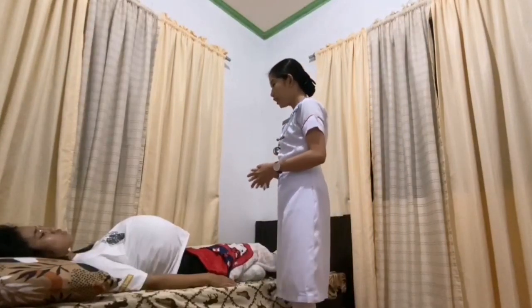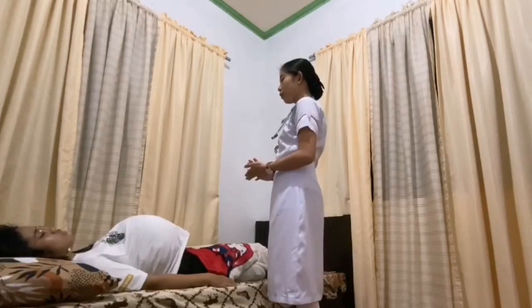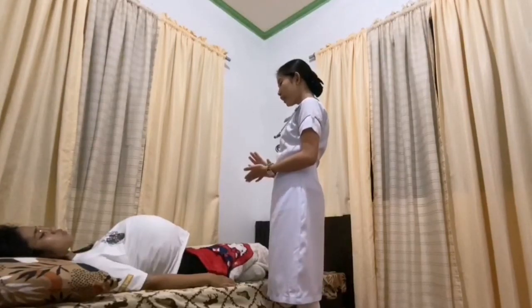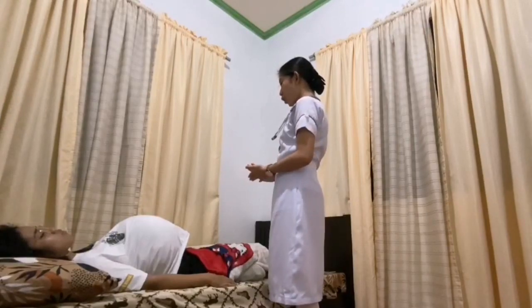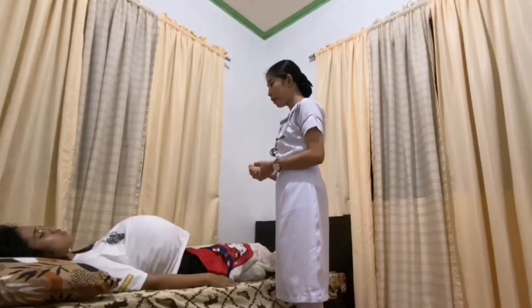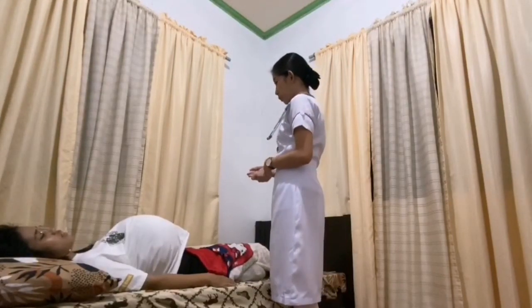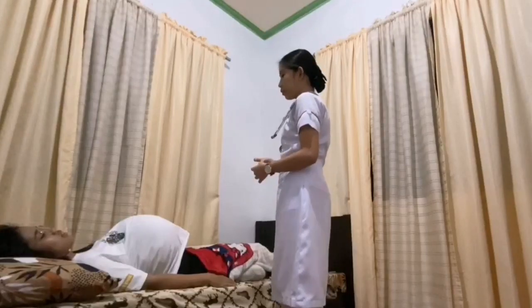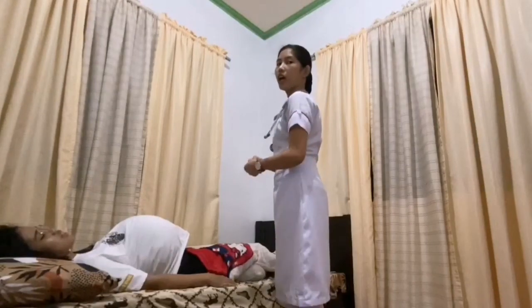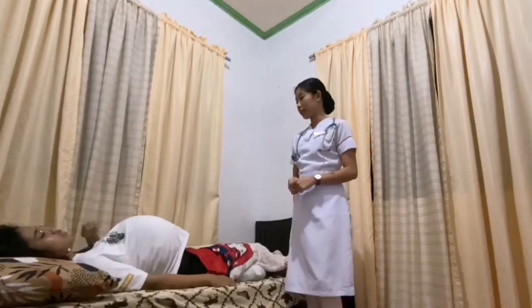So, good day, ma'am. I am Giuseppe Kumi, your student nurse for today, and the procedure that we are going to do is to take the fetal heart tone using a stethoscope. So, ma'am, would it be alright to auscultate your abdomen po? Yes. Okay. So, in this procedure, we are going to check for the baby's condition. Would it be alright with you, ma'am? Yes. Okay. So, the next thing is to find a quiet location, provide comfort to the patient.